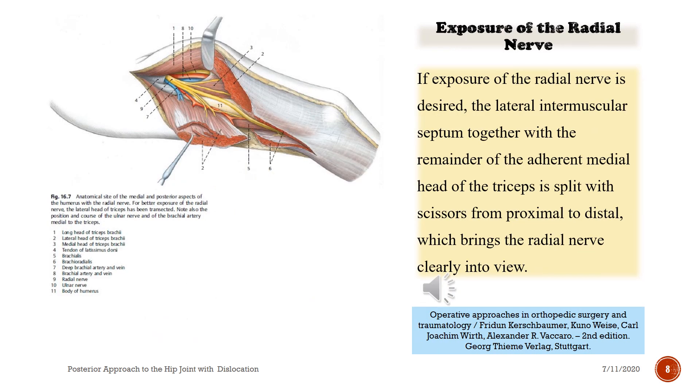If exposure of the radial nerve is desired, the lateral intermuscular septum together with the remainder of the adherent medial head of the triceps is split with scissors from proximal to distal, which brings the radial nerve clearly into view.